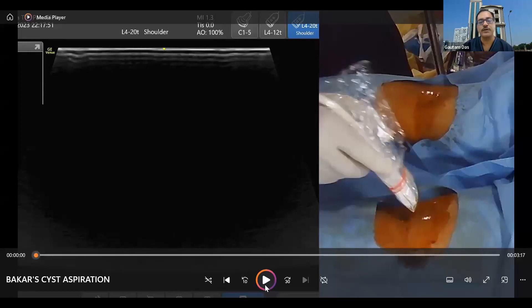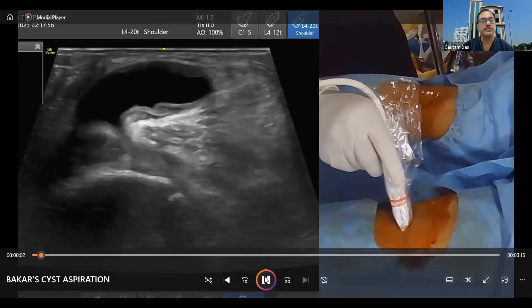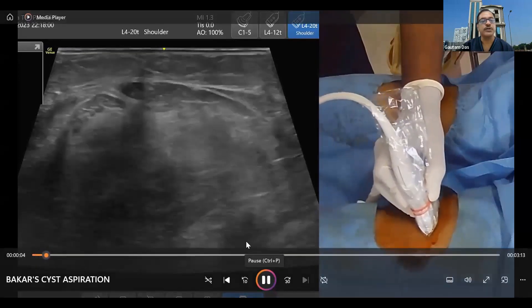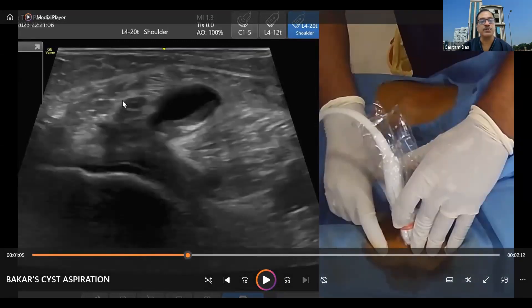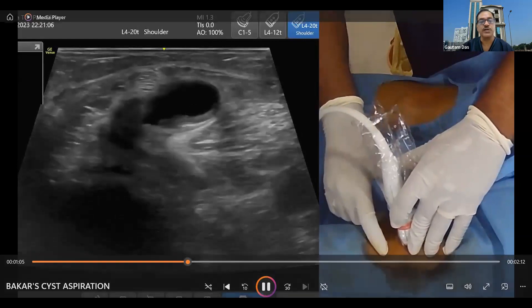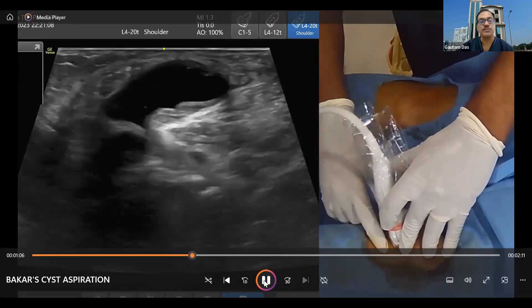This is the patient with a Baker's cyst. So here, what is important — when I am scanning a little bit up — this is your semitendinosus and this is your semimembranosus. It bulges between the semimembranosus and the gastrocnemius. So the Baker's cyst comes out from there, between the semitendinosus, semimembranosus, and the medial head of the gastrocnemius.